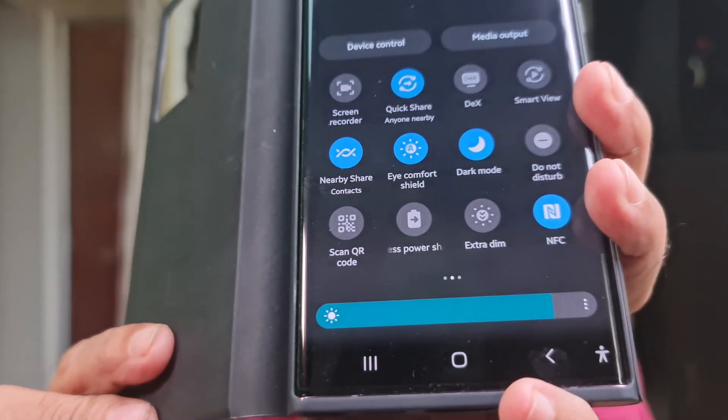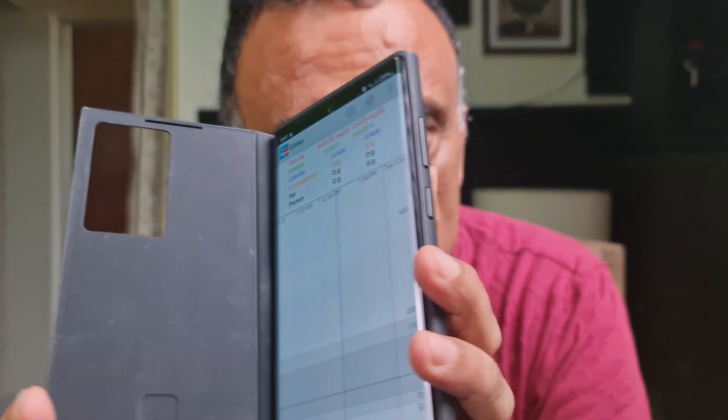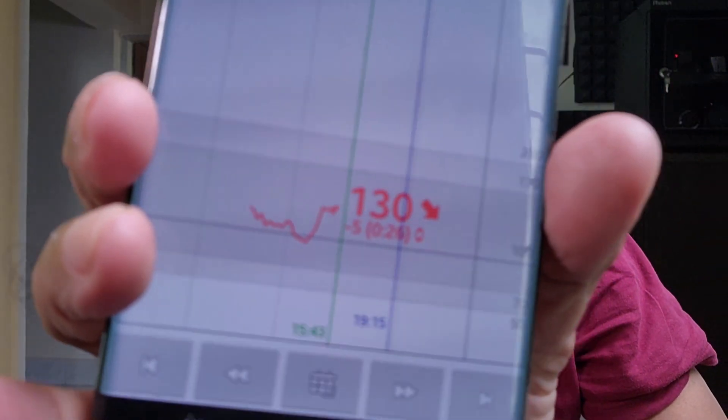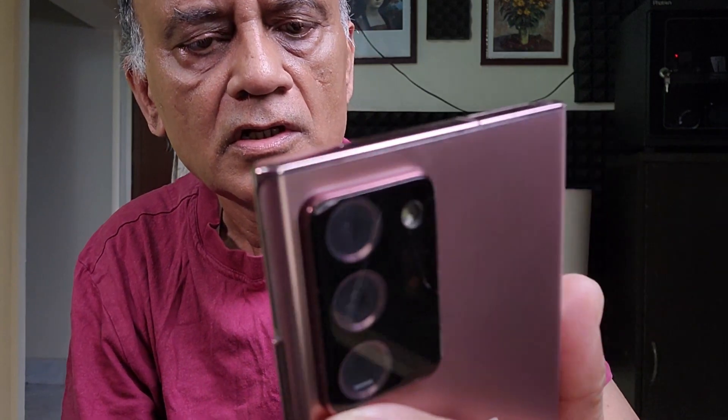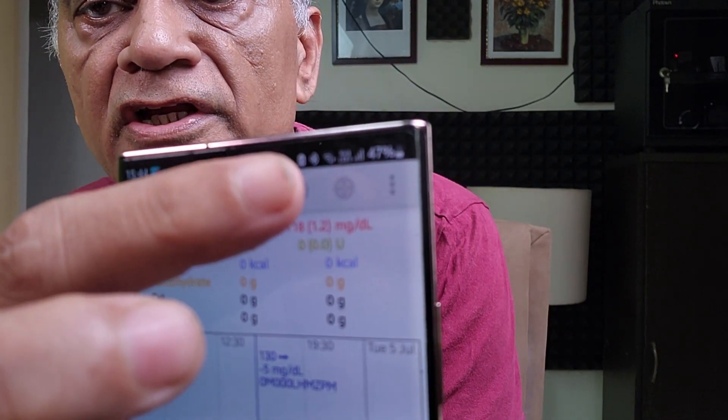Once you have the NFC active on your phone, all you have to do is open up the Glimp app. This is the interface. Place the phone over the sensor. You can see the previous reading — 130. I am going to take the phone and place it over the sensor. You heard the noise. And the reading is 130. The time is 15:44. You can see the time here, and the time here is also 15:44. So, you just took the reading now.